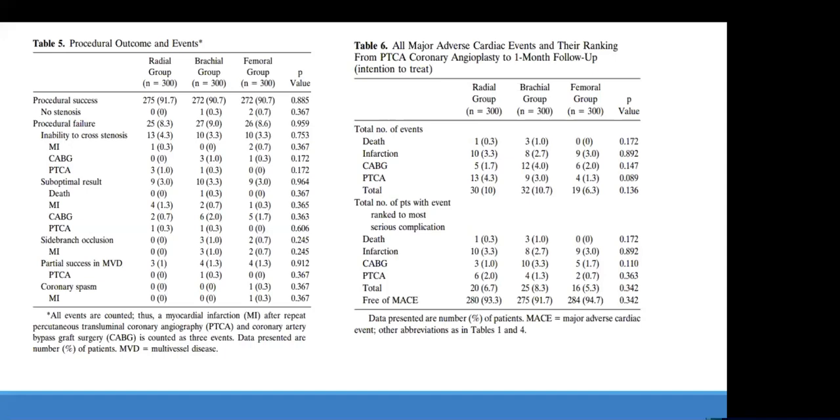It's actually the contrary. It does improve the patient outcome by comfort first, in that the patient can walk after the procedure. Number 2, prevent vascular complication. All this being said, it is important to know the femoral access.